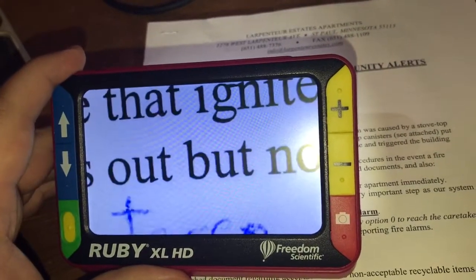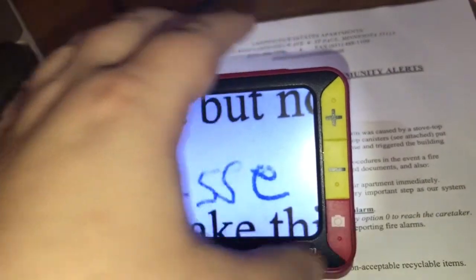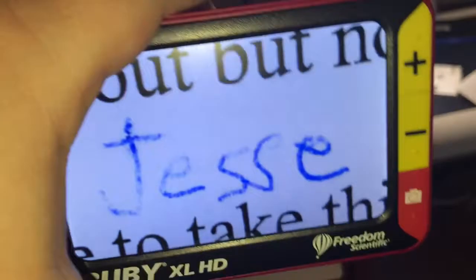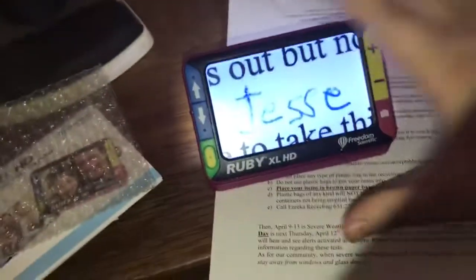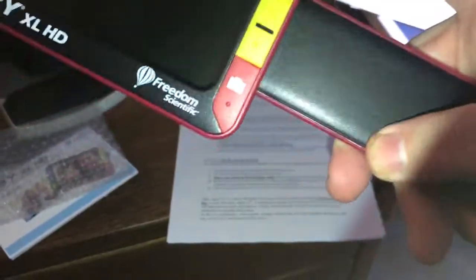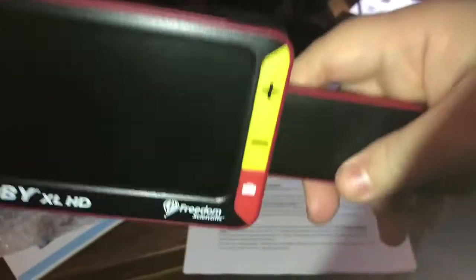Now the red button — we haven't touched on that yet. I've got my name focused on here, let me hit the red button. Freeze — I can pick it up. It's still on the screen but we're not looking at the paper anymore. So this is really handy. Also, there's another mode — a handle that flips out from the back. I can hold it like this, it snaps into place. Or I can flip it all the way behind, or flip it out like this.